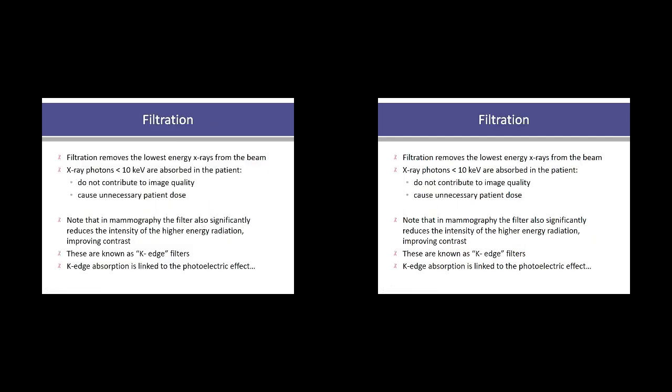So just to revisit the purpose of filtration, certainly within general radiology, it removes the lowest energy X-rays from the beam. X-ray photons below about 10 keV, maybe even 15 keV in general radiology, are just going to be completely absorbed in the patient and not really going to contribute usefully to the image. So they're not going to improve image quality, and absorption just means absorbed dose within the patient. So we have to get rid of the lowest energy ones, and that's true in mammography as well.